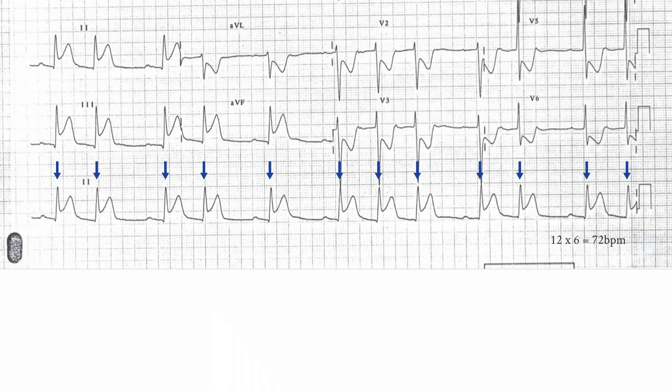The rhythm is difficult to be certain about. There are 12 beats recorded on this ECG, and the rhythm is clearly irregular. Some of these beats are preceded by what appears to be atrial activity, i.e. P-waves, and when P-waves are present, they're conducted with a PR interval which appears to be constant. These are therefore sinus beats.